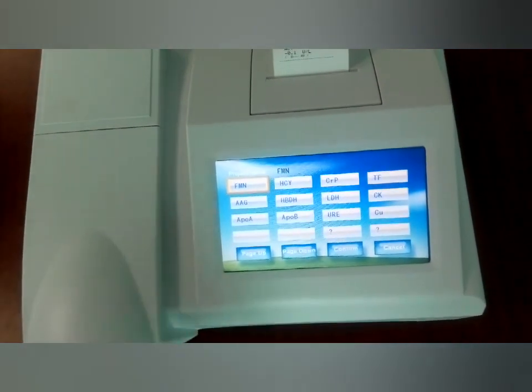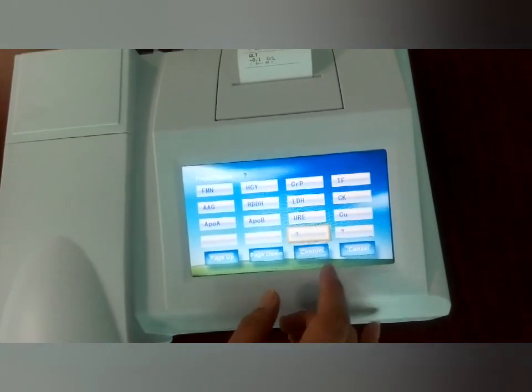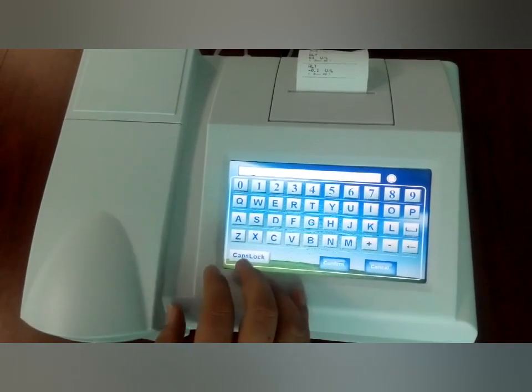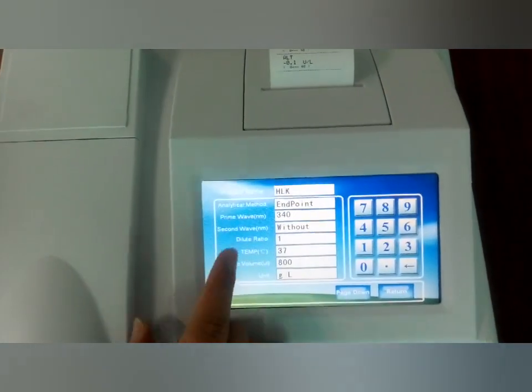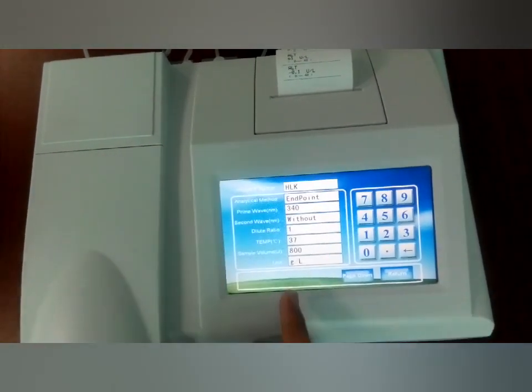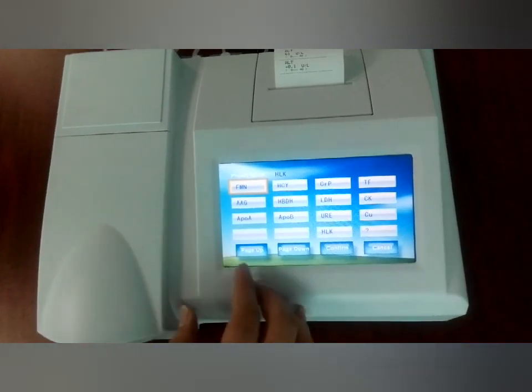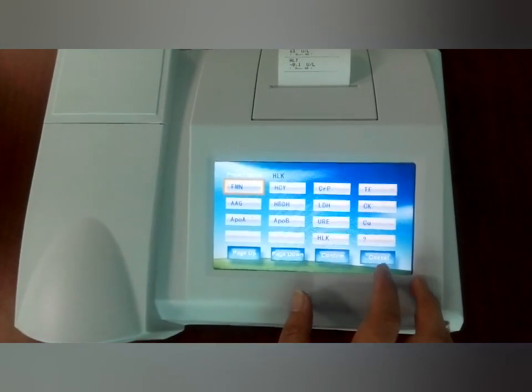If you cannot find the item you want to test, you can add it from here. Just click it and confirm. From here, you can write in the item name you want to test. For example, HLK — confirm. You can set the parameters here according to the reagent menu as the HLK should be tested. Page down, page down. After finishing this, just save and return. Now you can find the HLK here, then cancel it.